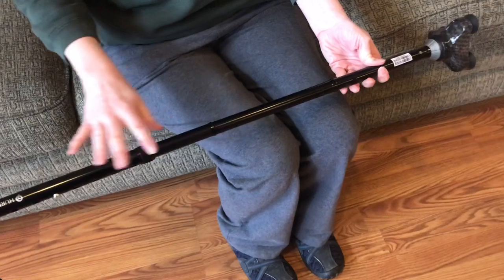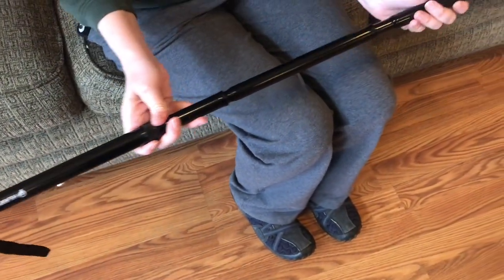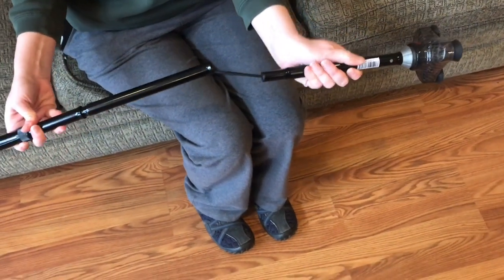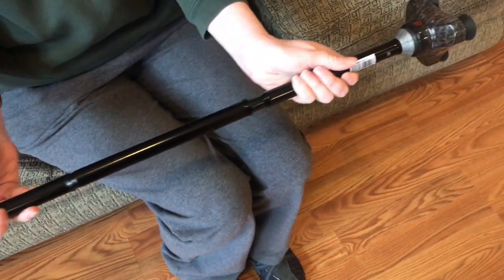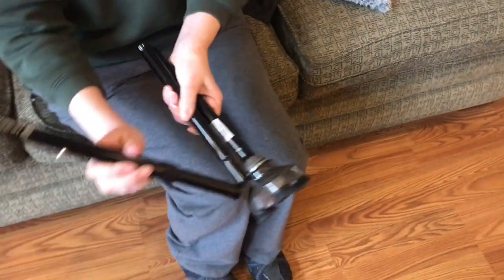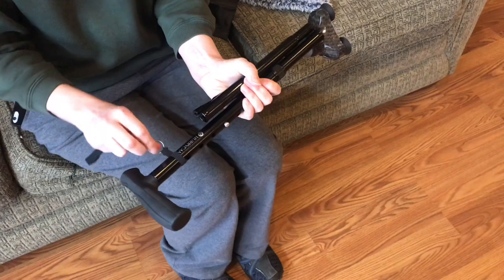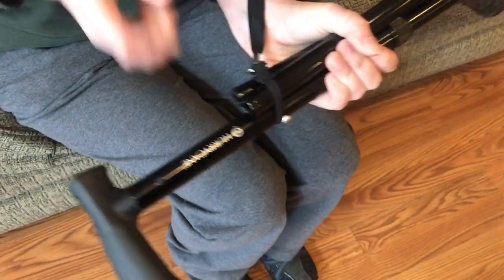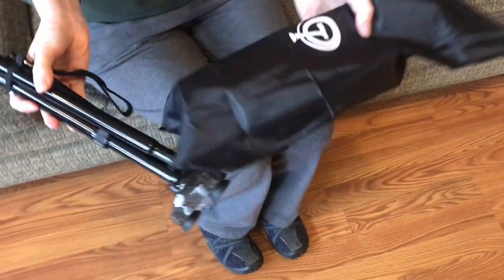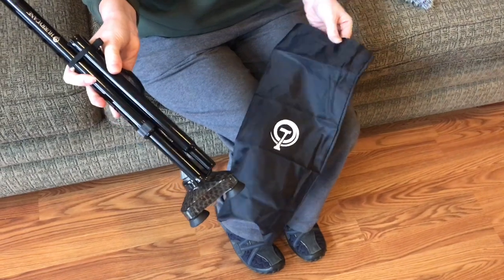To carry this Hurry Cane into the car with you, if you need it to fold up, simply pull on it — there's an elastic cord inside so no hardware involved. Just pull and fold, pull and fold, and to keep these together just pull on this elastic strap. It comes with its own carry bag if you should want to use it.